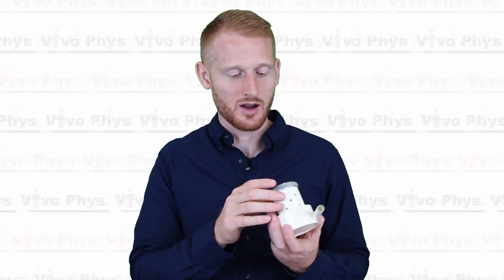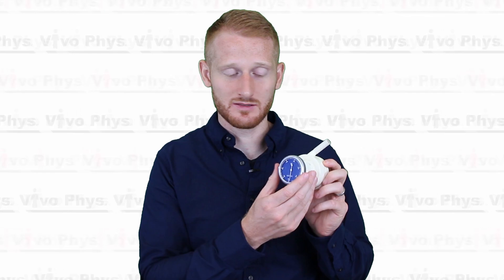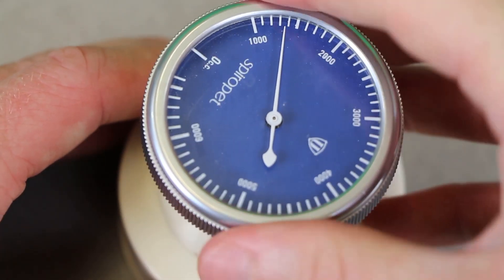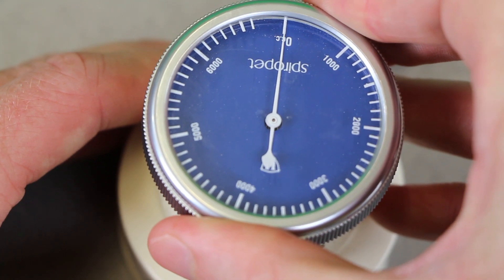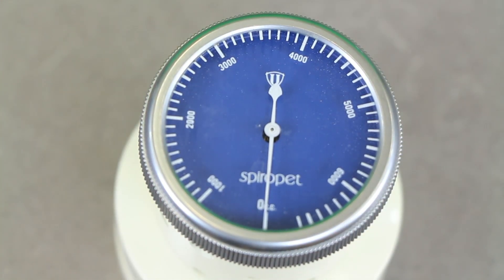The idea is to get as much air out of your lungs as possible. Also, before doing each trial, you need to make sure that you zero out the dial. On this particular model, the outside part turns and twists, which allows you to zero it out, so you just make sure the needle is on zero before you do the test.